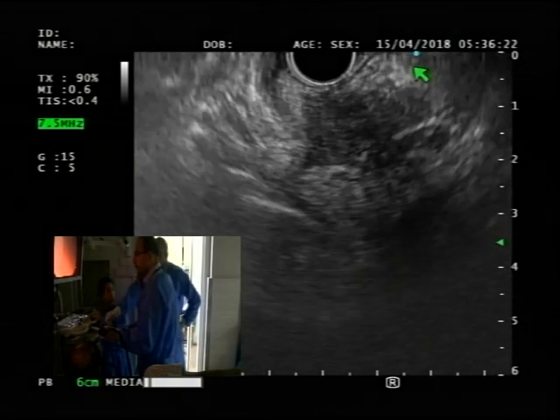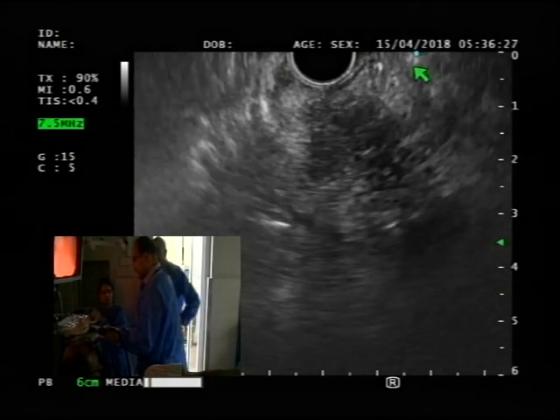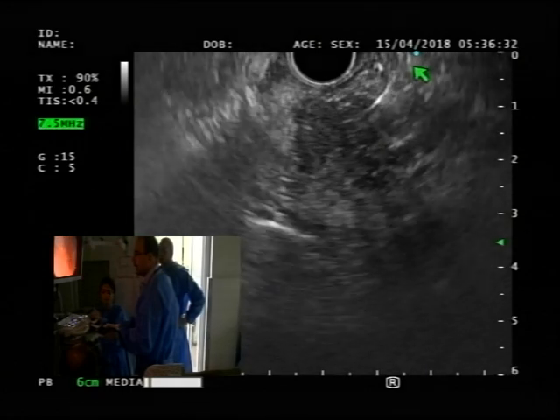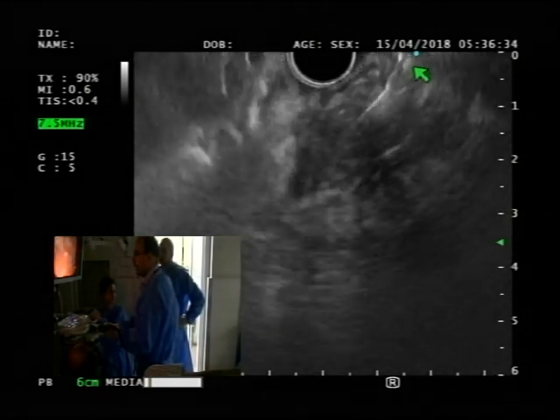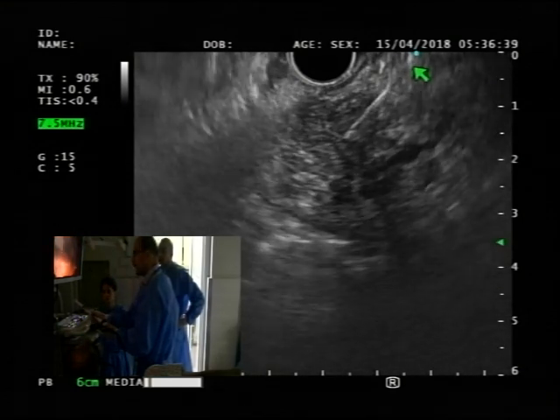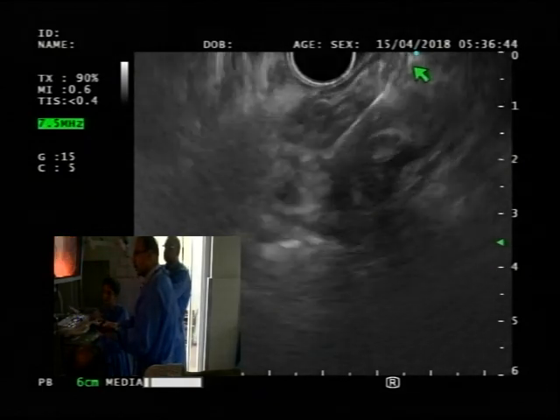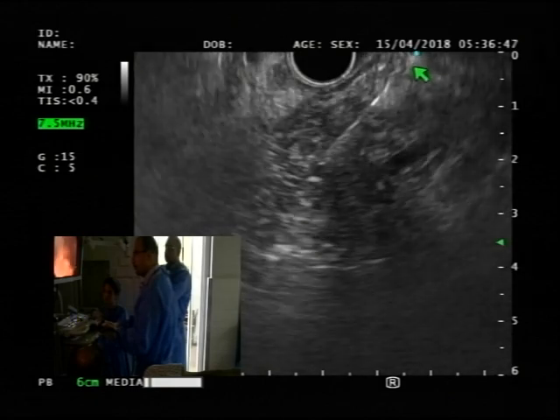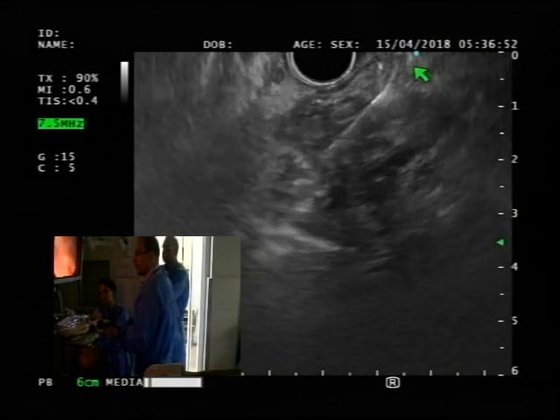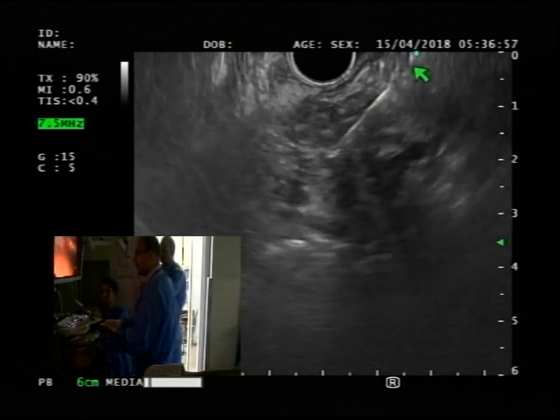For my reporting, he puts this on stop as well. Is that to protect so you don't go too far? Yes. I tend not to do it, but yes, that's the idea. Yeah, let's do it. It goes out of plane.